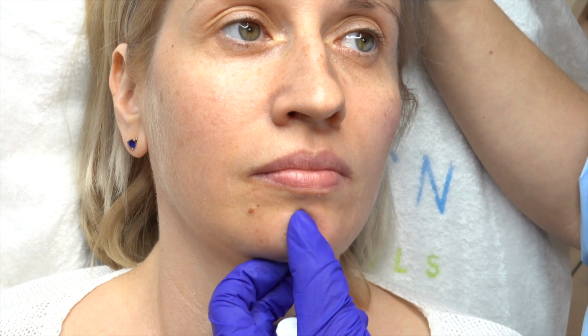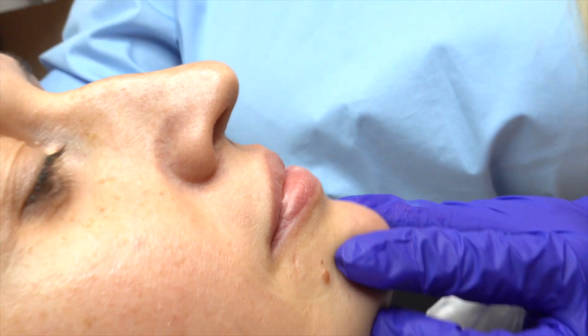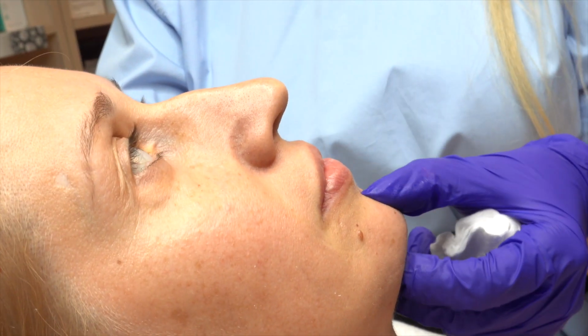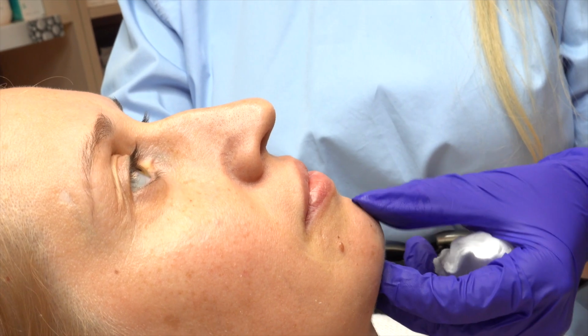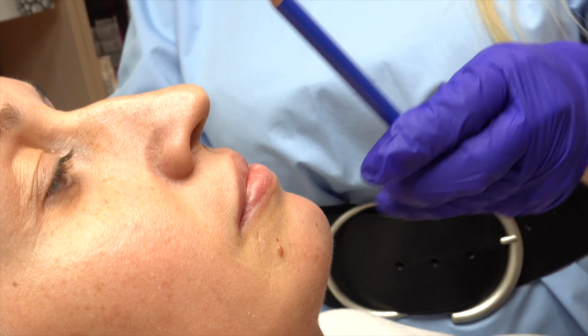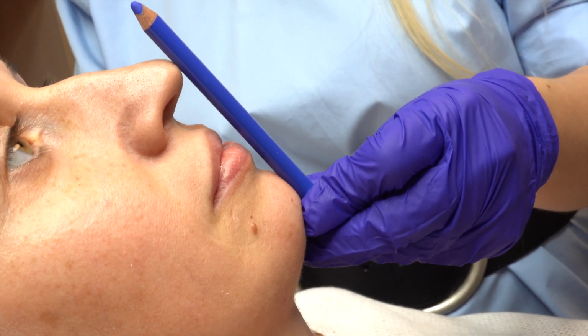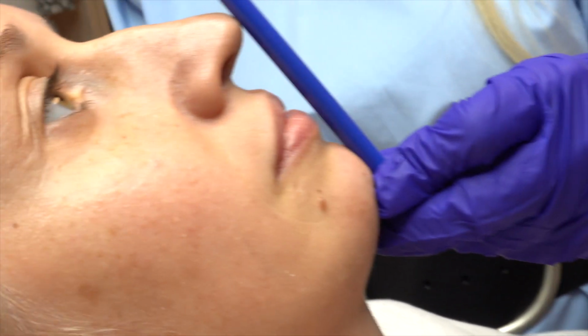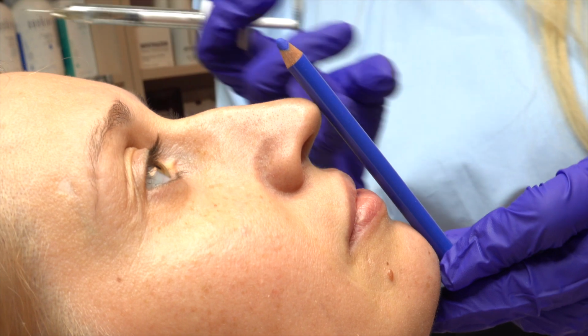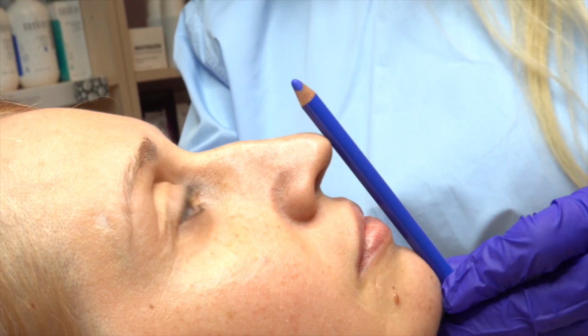This is an additional goal. You remember her Ricketts line. We need to settle the lower lip. You can look here on her face. It's become better. Her chin became better, longer jawline and slimmer chin and more defined cheeks. And now I want to double check her look to her Ricketts line. You remember her lower lip was touching the pencil, and now it's ideal. Can you see this gap between pencil and her lip? We improved this proportion and it's great.